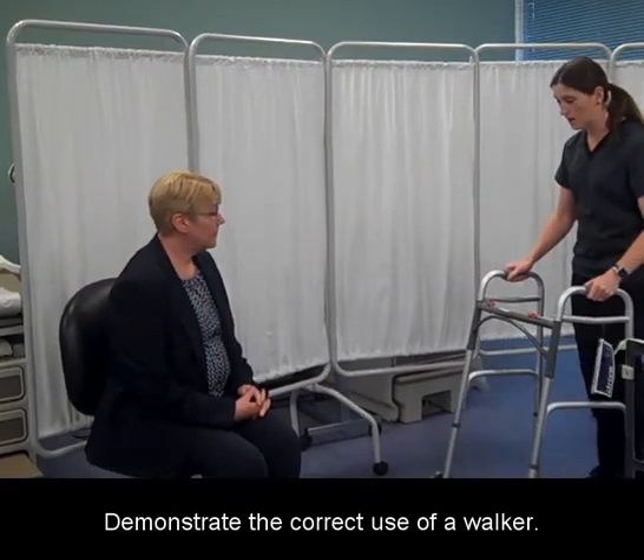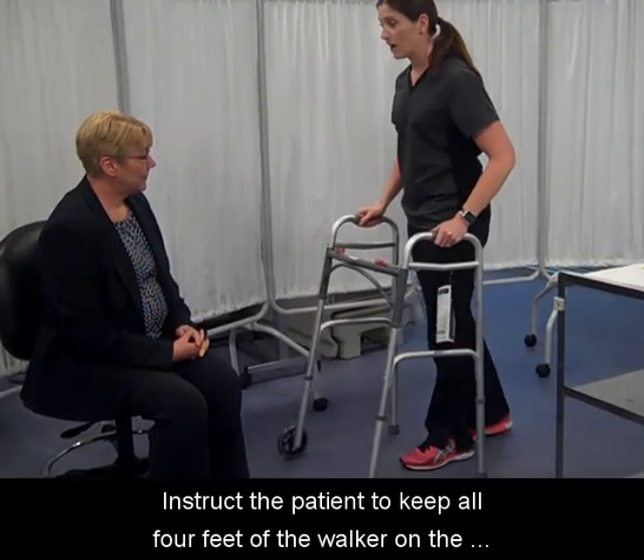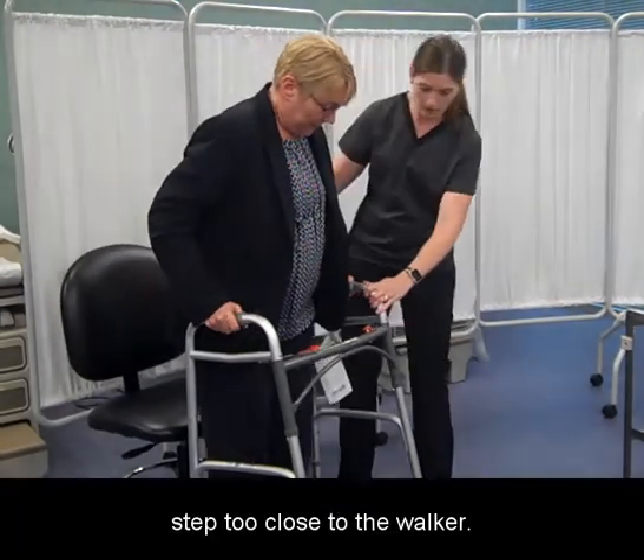Demonstrate the correct use of a walker. Instruct the patient to keep all four feet of the walker on the floor. Explain to the patient not to slide the walker. Instruct the patient not to step too close to the walker.